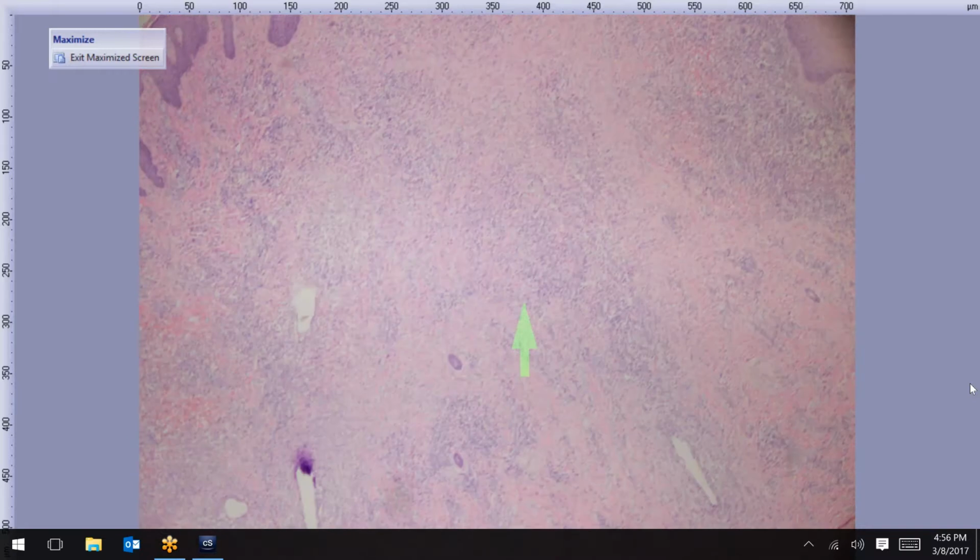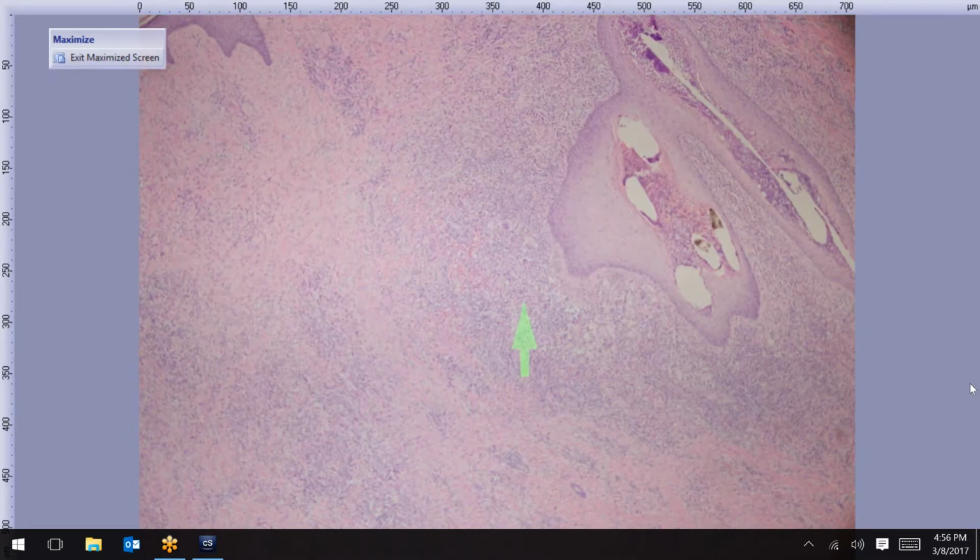Sorry, it takes forever for you guys to type it. So dissecting cellulitis, yeah, folliculitis decalvans can definitely give you that kind of pustular, follicular picture with scarring and inflammation. Dissecting cellulitis of the scalp, you can get it with hidradenitis suppurativa, can give you that picture. Pilonidal cyst can give you a similar picture.